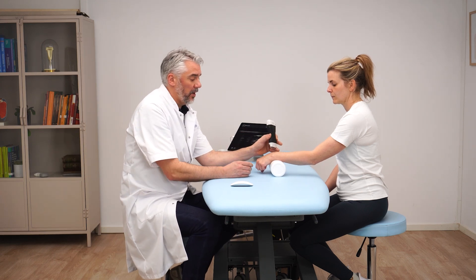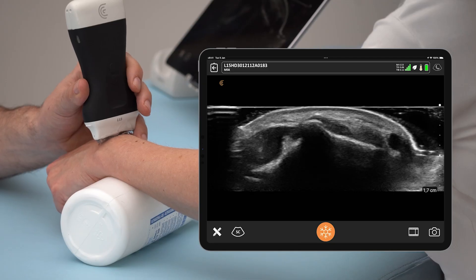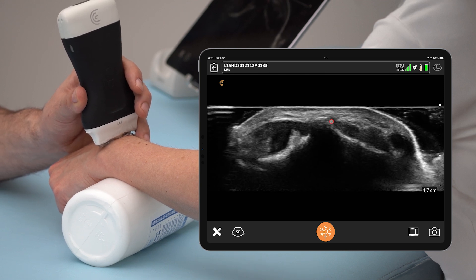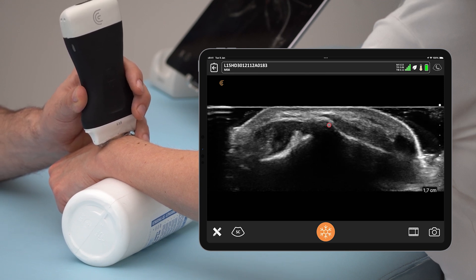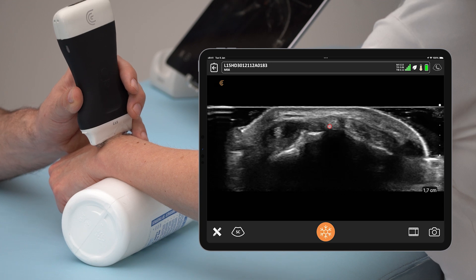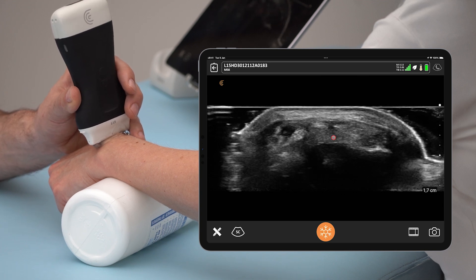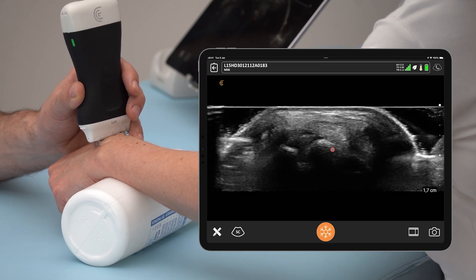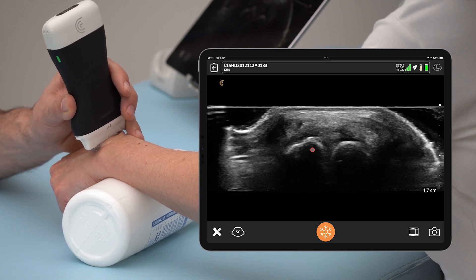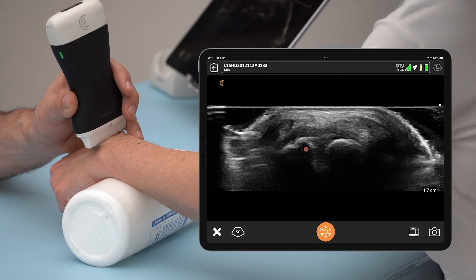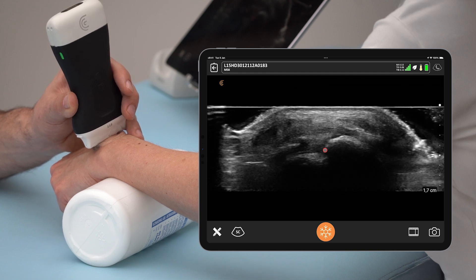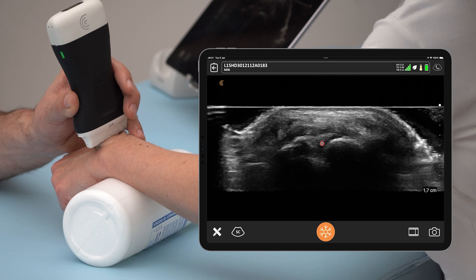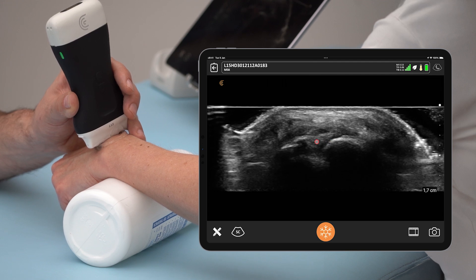I'm going to place the transducer on top of Lister's tubercle, which you can see right there. From here we slide distally so you can see the bone changing until we see the scaphoid bone and the lunate bone. In between the lunate and the scaphoid we can see the scapholunate joint with the scapholunate ligament, which is the hyperechoic tissue right there.